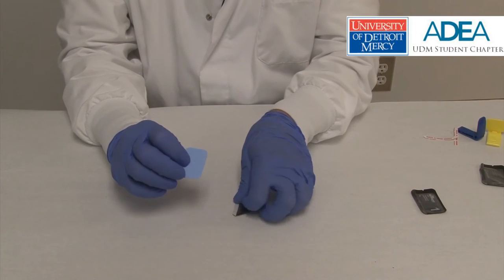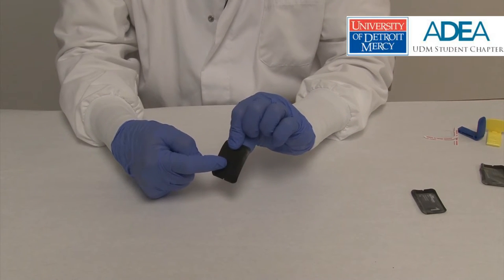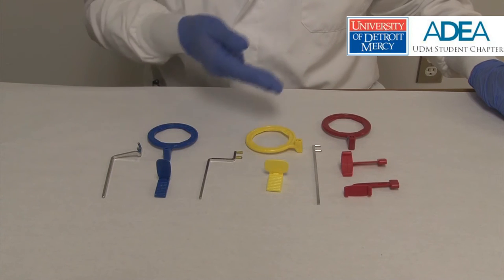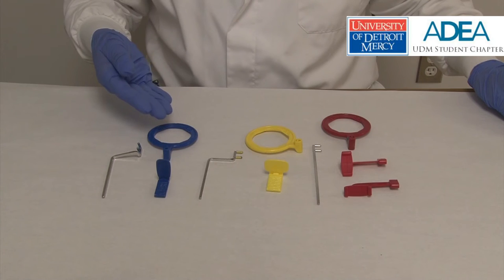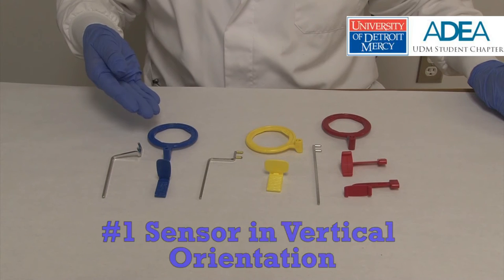By placing the sensor face down in the sleeve, we protect the resultant diagnostic image from the effect of ambient light prior to processing. The XCP unit uses three different holders to locate the sensors in a patient's mouth. The blue holder holds the narrow number one sensor in a vertical orientation to accommodate the longer but narrower anterior teeth in the narrow, rounded anterior part of the arch.